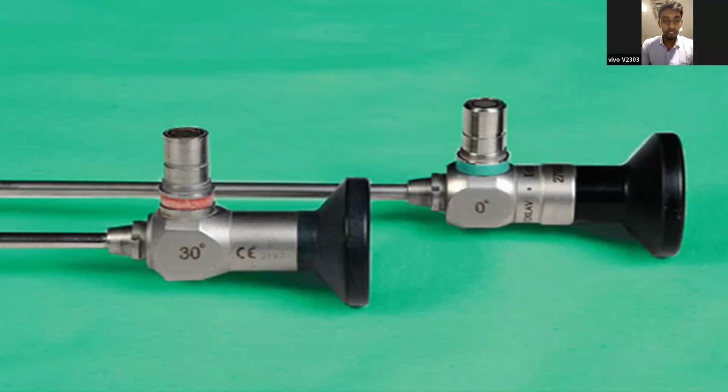30-degree scope is used for diagnostic cystourethroscopy, sir. Used for routine diagnostic cystoscopy, sir, and we are able to do DJ stenting, sir, and we can also do DJ stent removal.